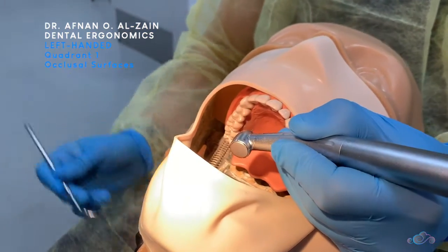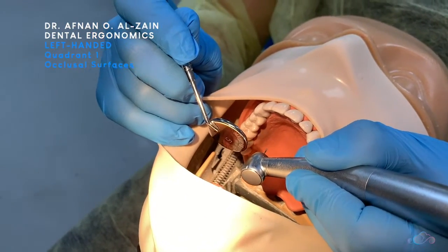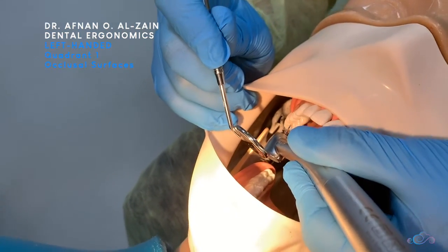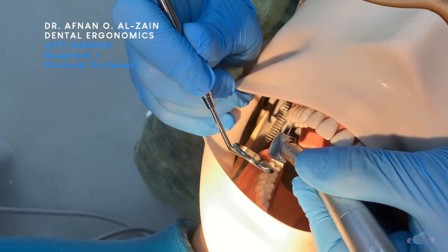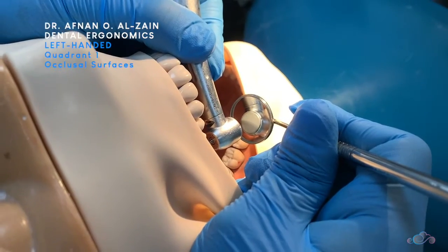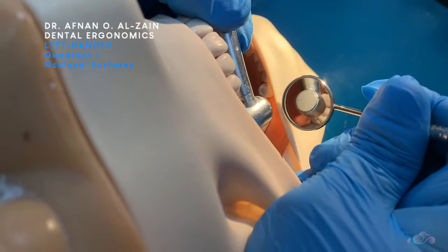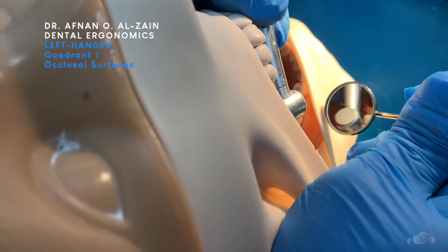After that you're going to place finger support on quadrant two and then extend your fingers so that you reach the occlusal surfaces of quadrant one. Make sure that you are perpendicular to the surface. Place the mirror behind the handpiece and then start moving it at an angle until you can clearly see the occlusal surfaces.